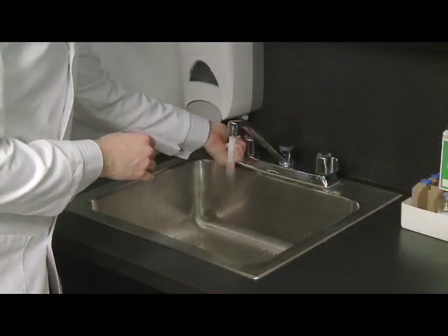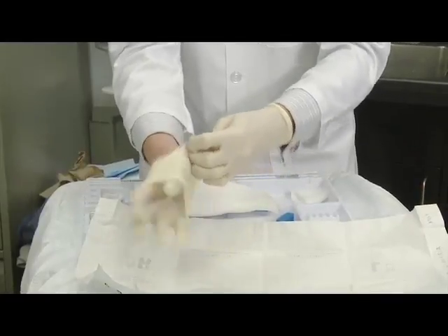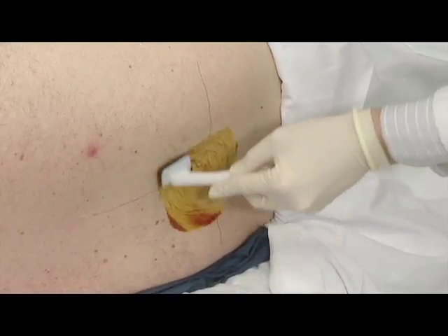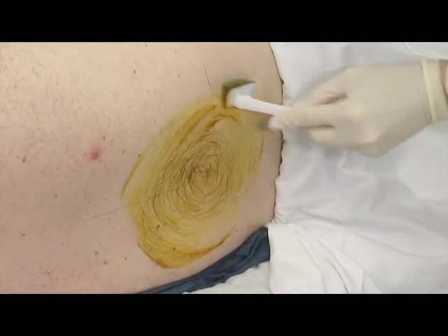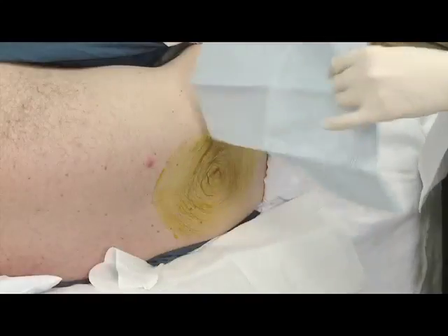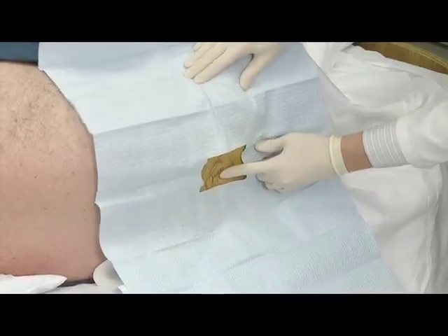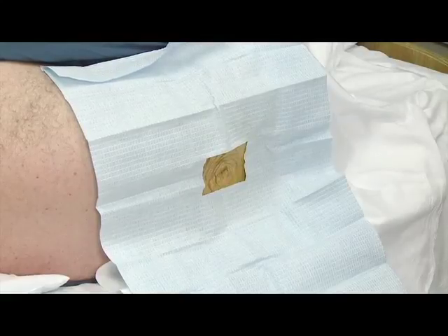Next, wash your hands and put on sterile gloves. To prepare the patient, clean the patient's back using antiseptic solution on the swabs, starting from the insertion site and making expanding concentric circles. This should be done 3 times. Cover the area with a sterile drape, making sure the window is overlying the insertion site. It is helpful to apply the sterile drape over the iliac crest in case you need to repalpate the landmarks.